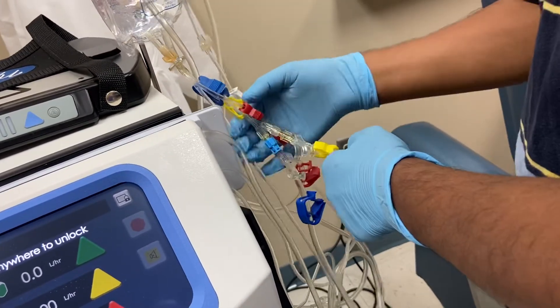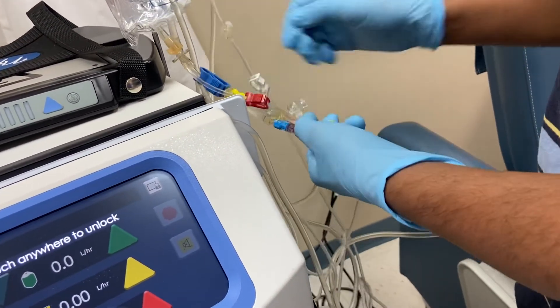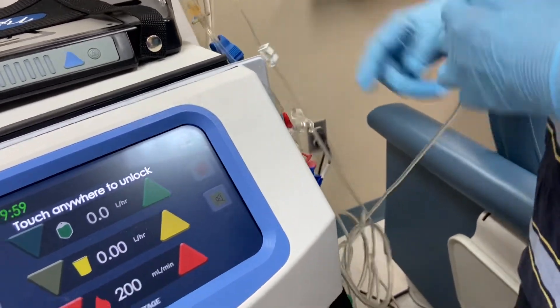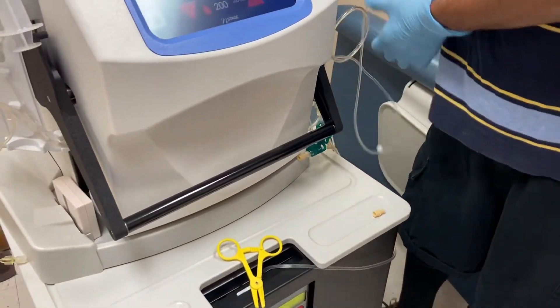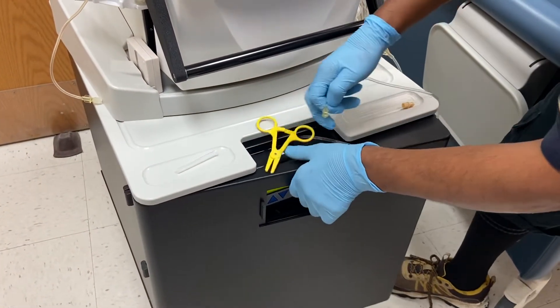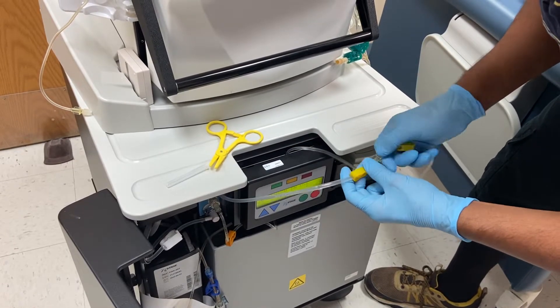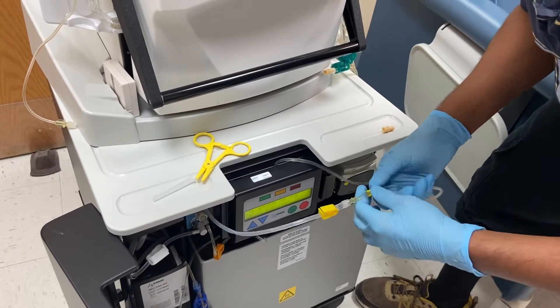Close both yellow clamps, then disconnect. This line doesn't need to be clean because it goes to the drain. Open both yellow clamps.